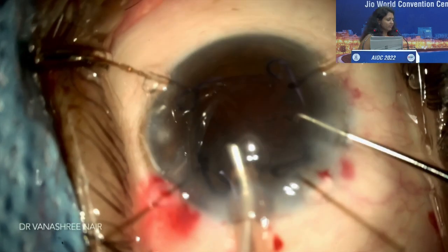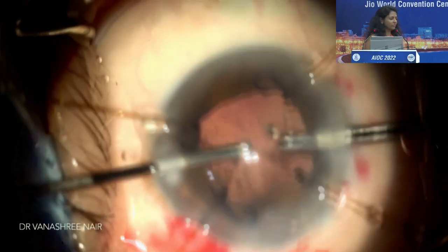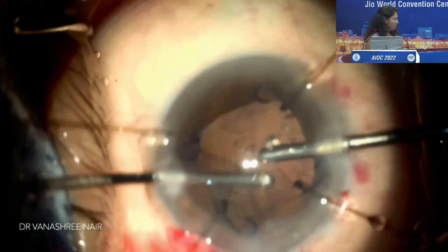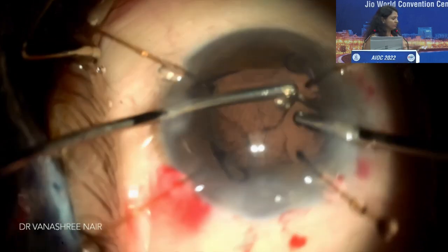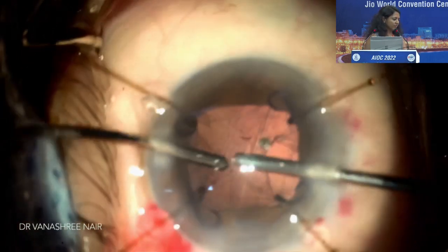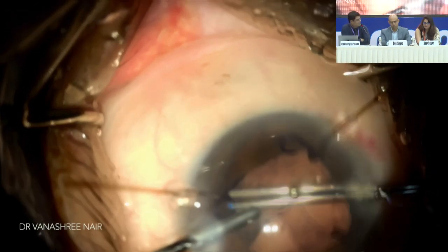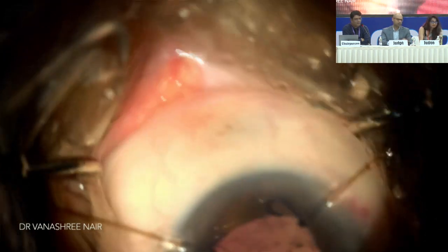Yeah. So slowly and carefully, I took off that piece, and for irrigation aspiration, I knew that this is going to be a little bit of a challenge because the CTR is already in place. And what I realized is it was a sticky kind of a cortex, so there was a little bit of a struggle. But I thought, let me go slowly and try and use a tangential method to pull off the fibers. And so at this stage, would you like to take off your capsular hooks before doing IA? Because CTR is already there, it's giving good equatorial stretch. What's your idea? You can if you want to.